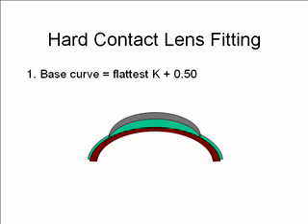and that's going to introduce a tear lens. And that tear lens is going to have a power. Let's figure it out here. If the cornea were spherical, what is the power that the tear lens would have if we're vaulting the K by 0.5? Well, this is a tear lens that is thicker in the center and is thinner towards the edge, so it's going to be a plus lens. And what's the power of the plus lens? It's 0.5.